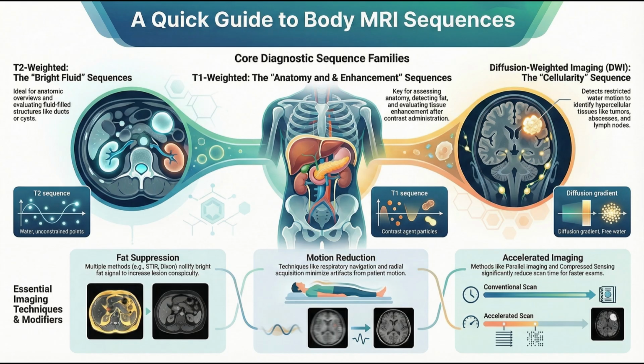A massive opportunity. Think about a rectal cancer staging protocol. You need to stage the tumor locally, but also check the liver for mets. So you inject the gadoxetate, get your dynamic vascular phases, and then you use that mandatory 20-minute waiting period to acquire all your other sequences. The T2s, the high-res pelvic images, the DWI. It makes for an incredibly efficient protocol with zero wasted time.